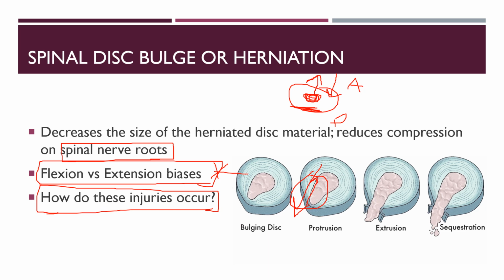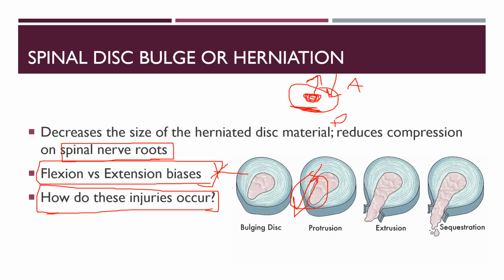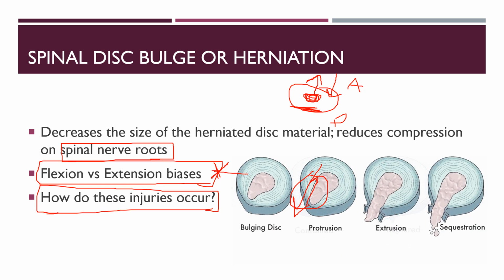So if you have questions about that, please let me know. Students tend to struggle with that at times, so come see me if you're really struggling with that concept. But understanding this flexion and extension bias will help you position your patient better for when you're actually performing mechanical traction.